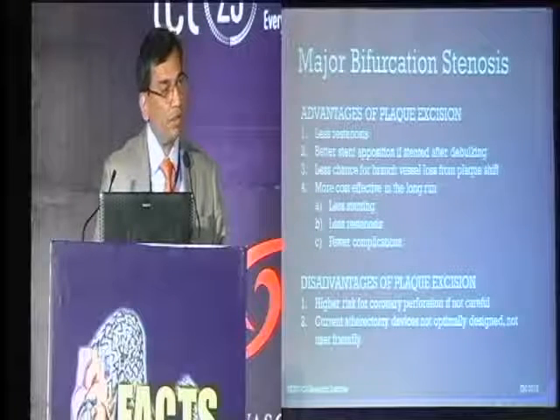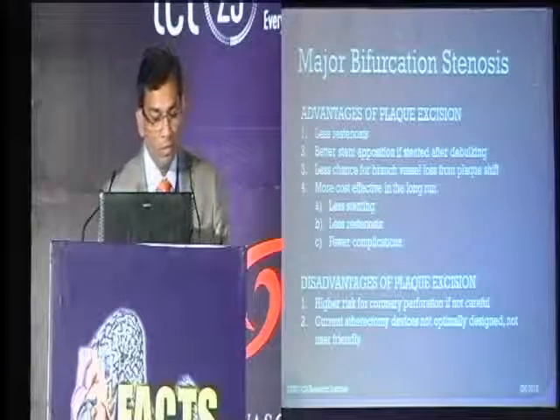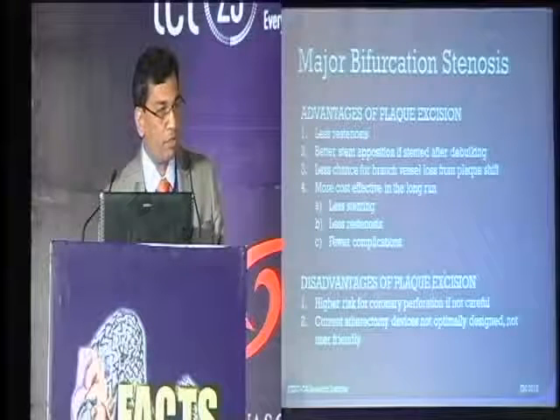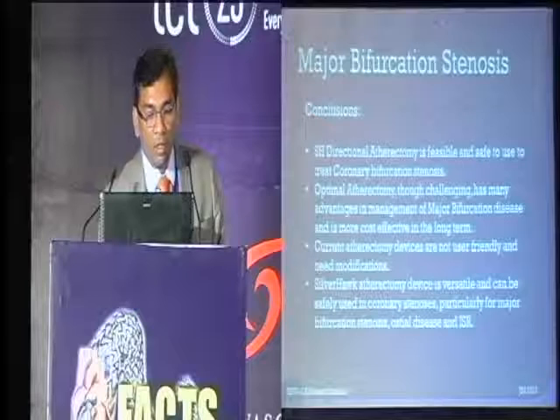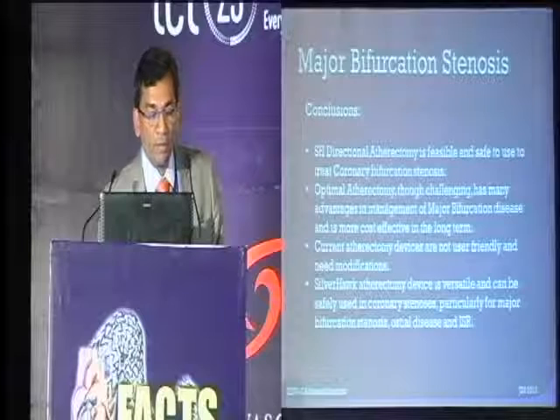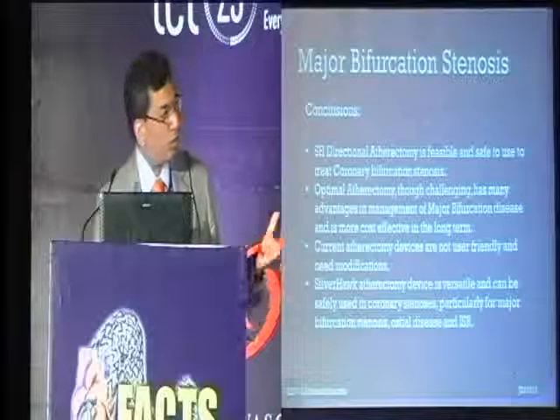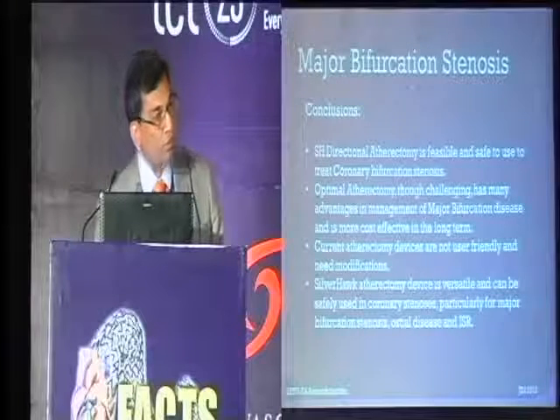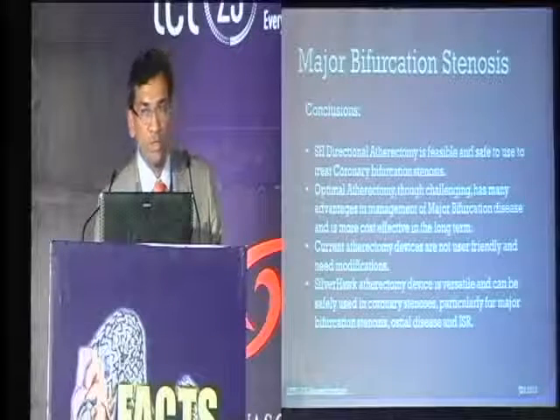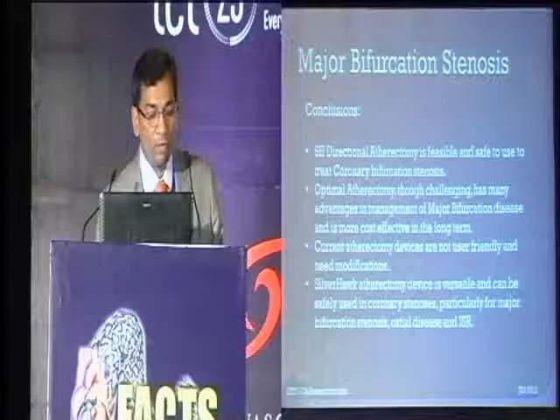I tend to minimize stenting when I commit to atherectomy, since that's a cost-effective measure and is also not necessary if you really get a good result with atherectomy. Major atherectomy catheters have been around. Most of the Flexi-Cut or directional atherectomy catheters are bulkier. In fact, I've had a lot of experience, as I said, with Silverhawk. The smaller version of the Silverhawk device works very well in coronaries, and we've had a lot of experience with it.